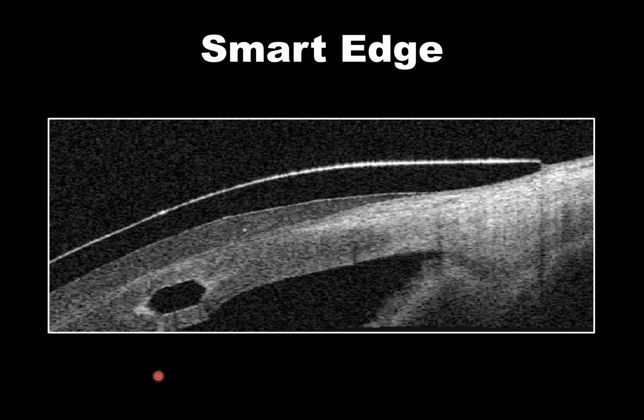And that's seen here in this image where you have the vaulting through the corneal and limbal tissue, but then you have this perfect relationship of lens touching down, distributing its force. But then at the edge, notice that half of the apex of the edge is above the eye surface, half of the apex of the edge is landing in the surface as that lens sinks into the conjunctiva.